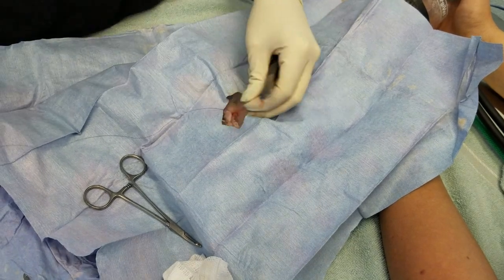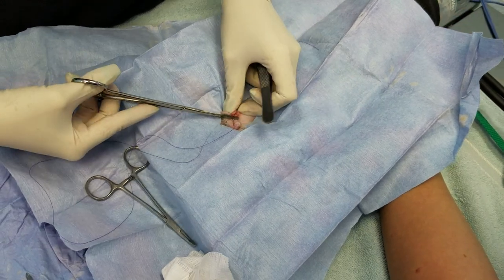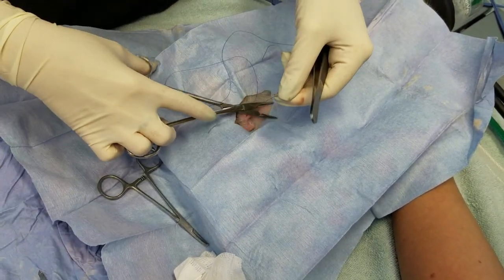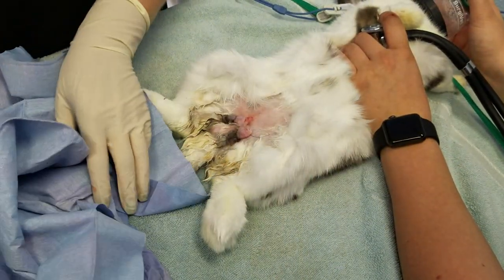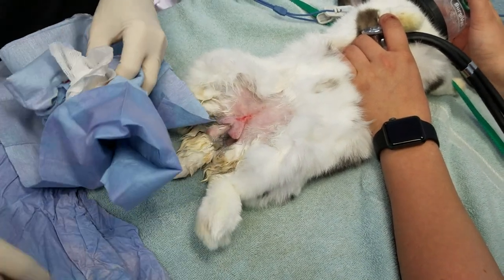You can turn his ISO off now. And bury our knots. And we now have a nice neutered bunny. We're gonna give him a tattoo and send him home.